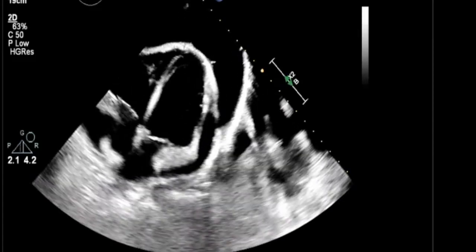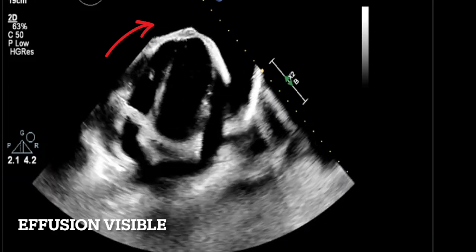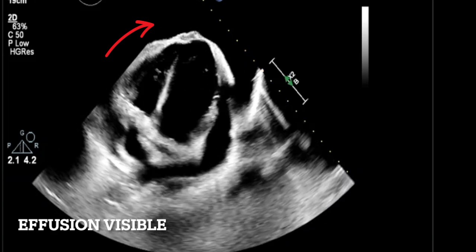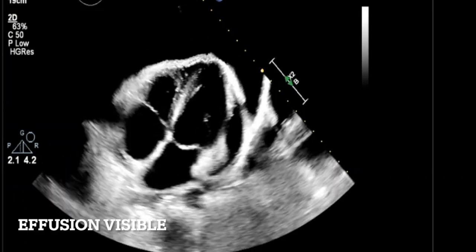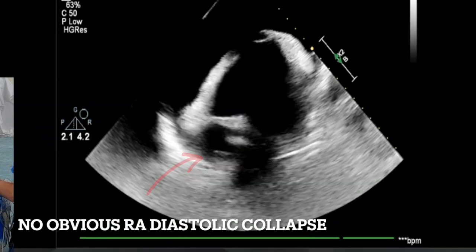Here's the apical view — my favourite. Again you can see the heart wobbling in the middle with a bigger effusion, but this time no large grey shadow in the way because there is no lung and no liver in the way, and we found a gap between the ribs for the echo picture. This is a much better position and more comfortable for the patient as well.